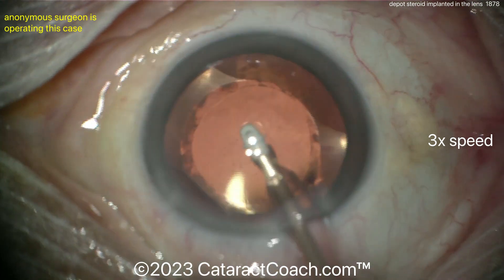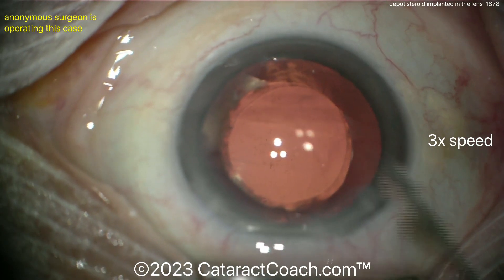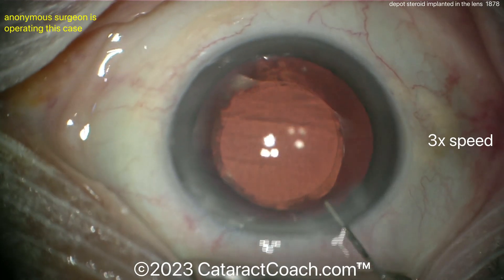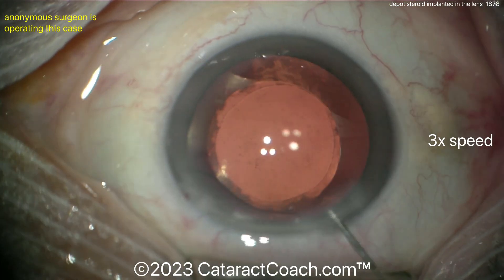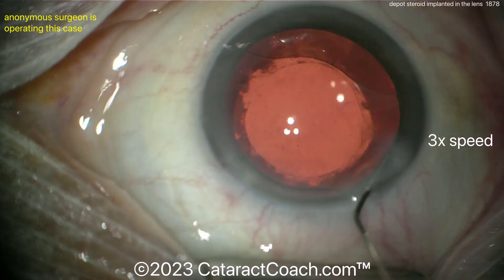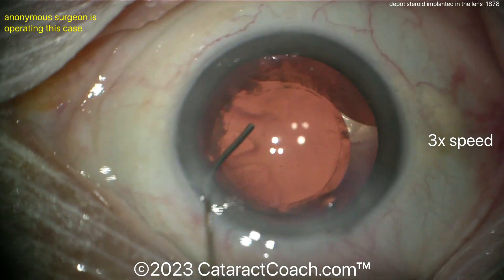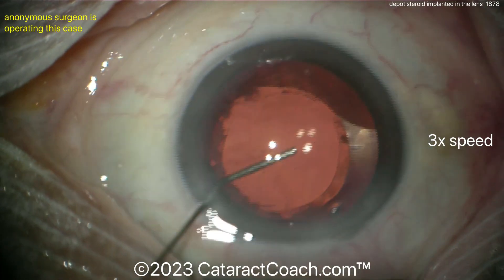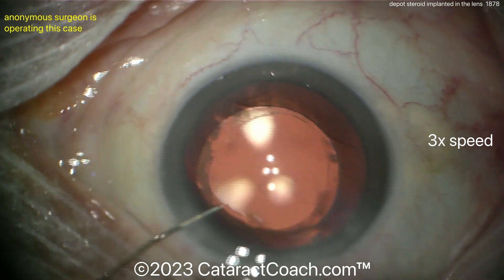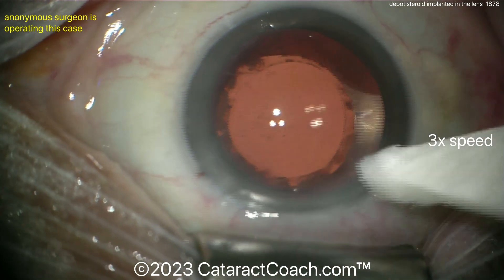That looks pretty good. My approach would have been slightly different: I would have first lifted that misplaced depot implant into the anterior chamber and explanted it, then proceeded with nucleus removal. I liked the visco-dissection and would have done a three-piece lens with haptics in the sulcus and optic capture through the rhexis. The triamcinolone at the end confirms no vitreous prolapse — a beautiful result. The patient is going to be very happy, and next time we'll aim that intravitreal implant a little more posterior to avoid the crystalline lens. Interesting case — now you know how to solve it.